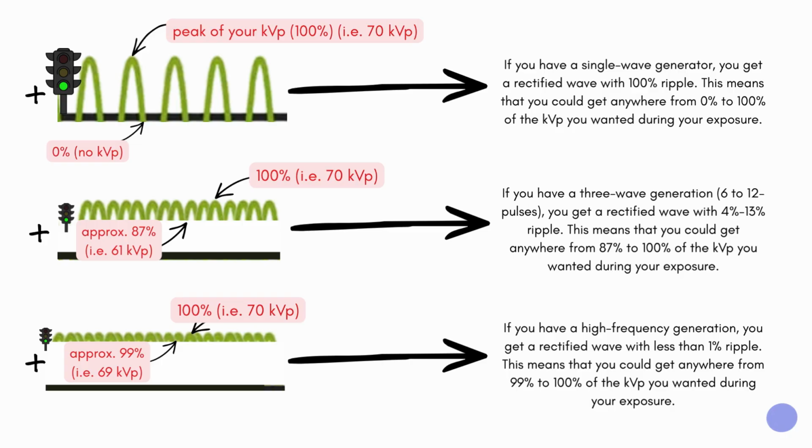These are what we mostly use. You'll find these pretty much everywhere now, like in our X-ray lab. The high frequency generator is a massive amount, the frequency is so fast that what you'll end up getting once it goes through those rectifiers, right, is pretty much the kVp you set. Whatever you set, that's what's moving through and forcing through the system as you go.